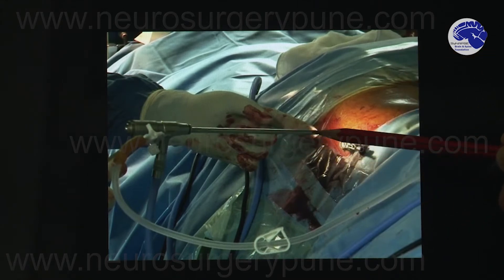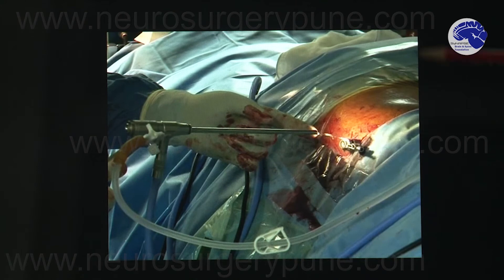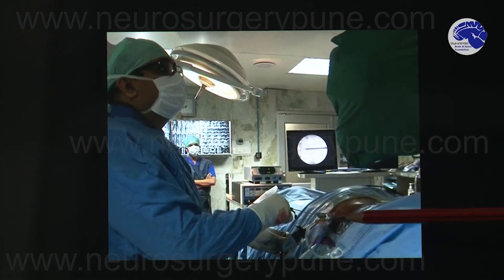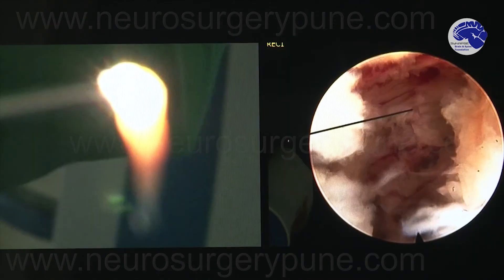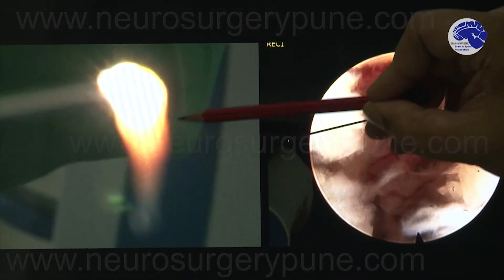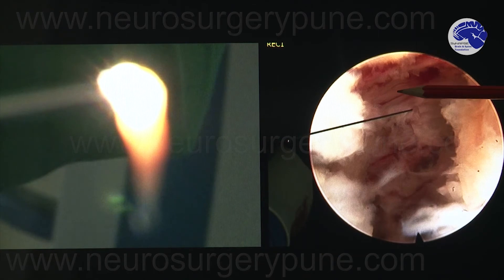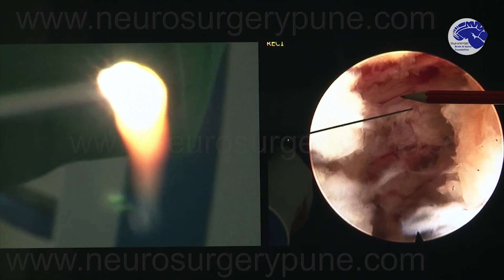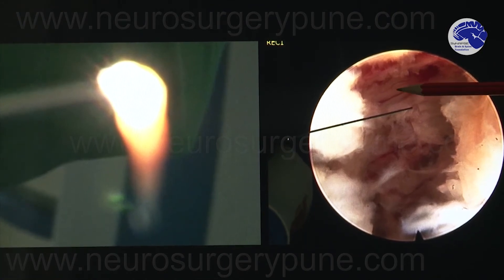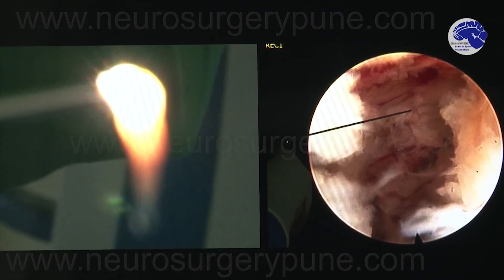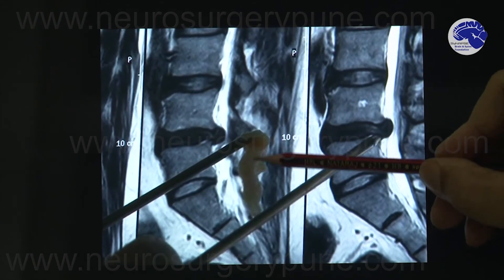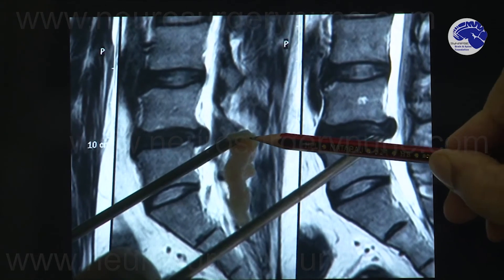The endoscope, which is roughly the diameter of a fountain pen, is passed through this channel to the place where there is a disc prolapse. As you can see, we are operating with a large forceps passed inside through the endoscope channel, and the culprit fragment of the disc is removed. The large fragment was pressing on the nerve as we saw on the MRI. You can see a small hole through which this fragment had entered, and if you focus carefully you will see the nerve, which is now decompressed. After surgery I took this photograph to show how the fragment looks after removal.